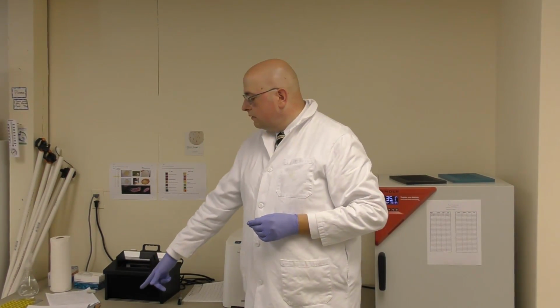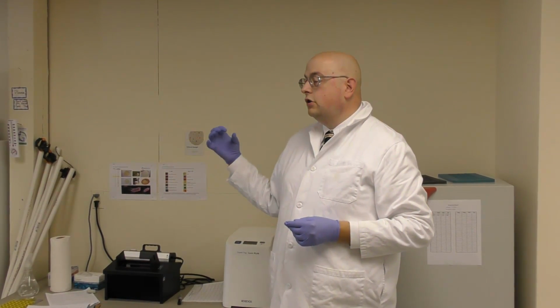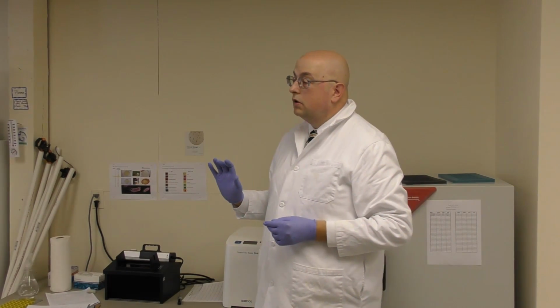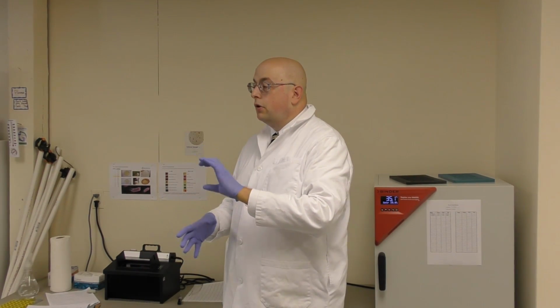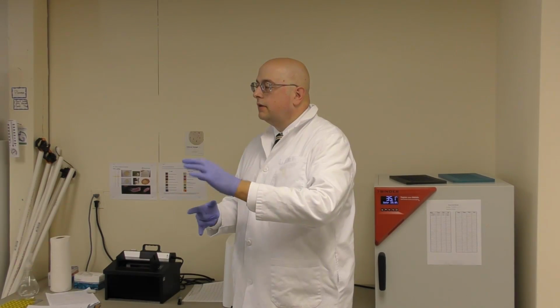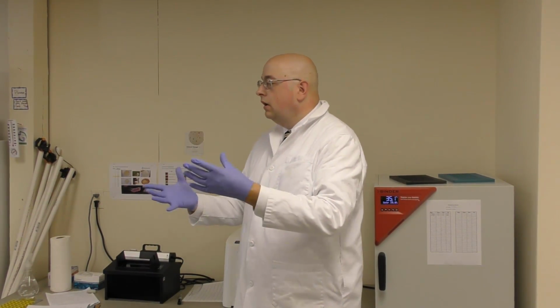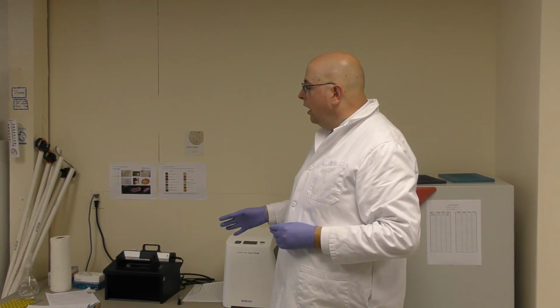Okay, a blank sample, that's just to verify that your bottles are sterile, and it also verifies that any equipment that's coming into contact with your sample is also clean. And it also checks to see if the technician or the field person is using good protocol. You know, they're wearing gloves and what have you, and they are not adding bacteria due to handling the bottle like they normally would while they're processing or collecting their sample.